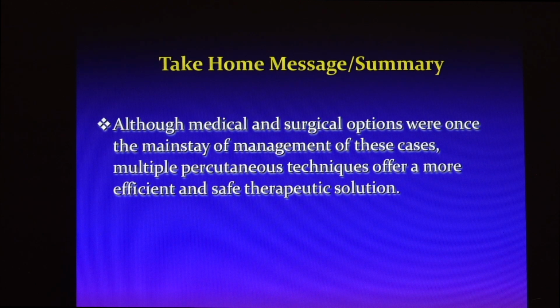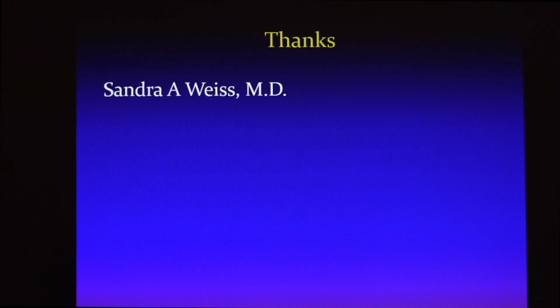So in the past, most of these cases were managed medically and surgically. Now we have many options for percutaneous interventions, as I said. Thank you very much. I want to thank my co-operator, Dr. Weiss, as well. Great, that is a great case.